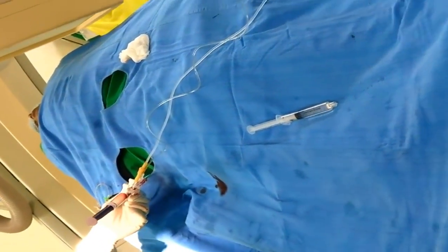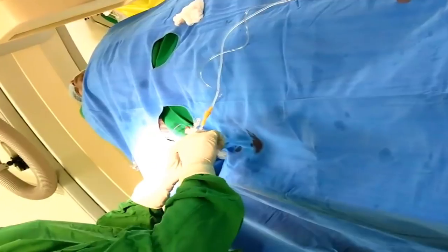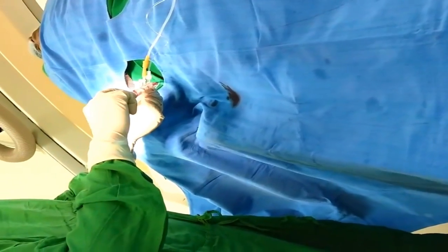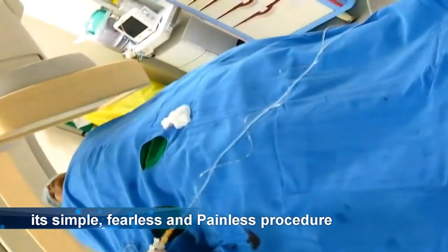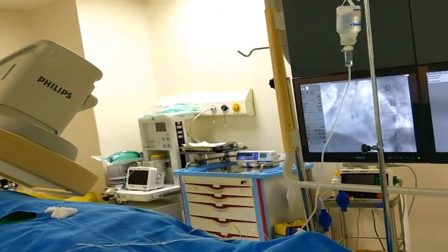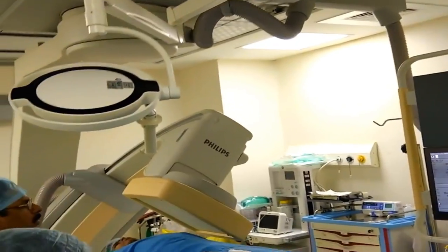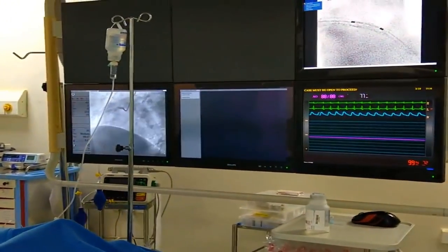Now I am aspirating contrast into the syringe. This is the contrast connected with the syringe. We have to ensure there should not be any micro air bubbles — if we leave air bubbles, the patient may develop air embolism, and sometimes acute myocardial infarction due to air embolism.